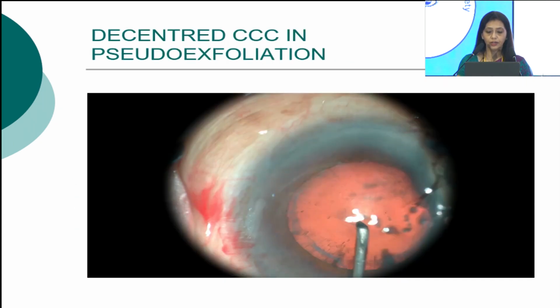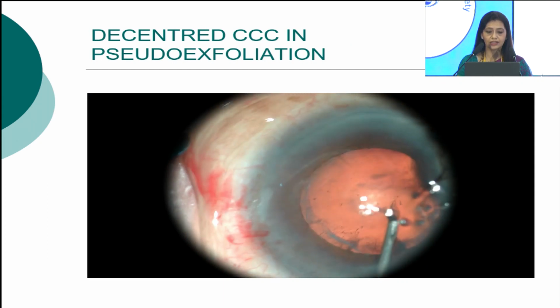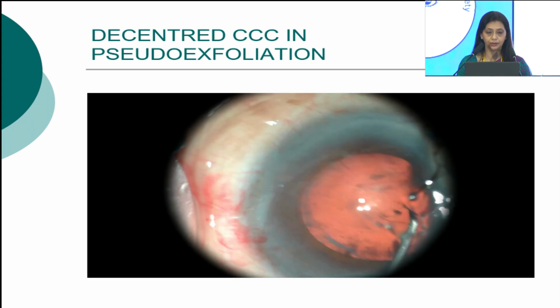This is the second video, a case of pseudoexfoliation, and if you see closely, the rhexis has not started from the center.